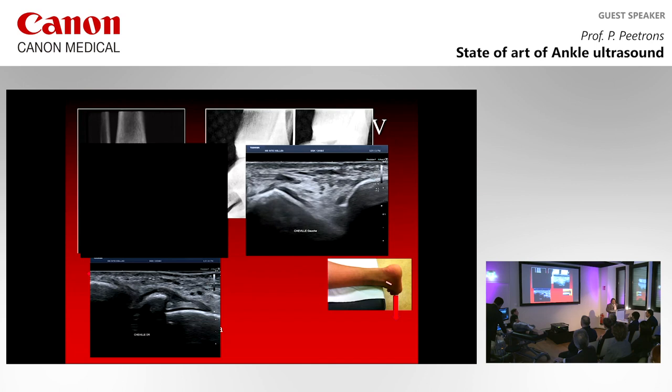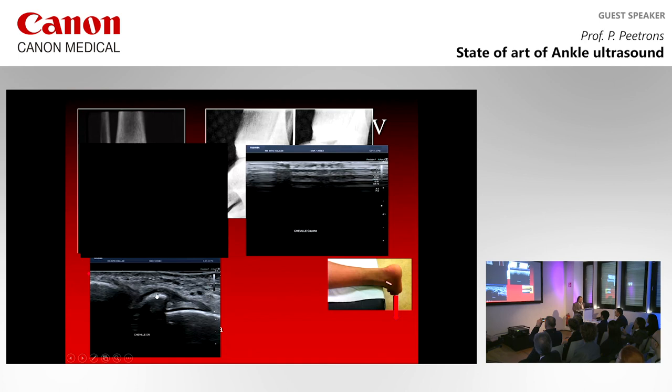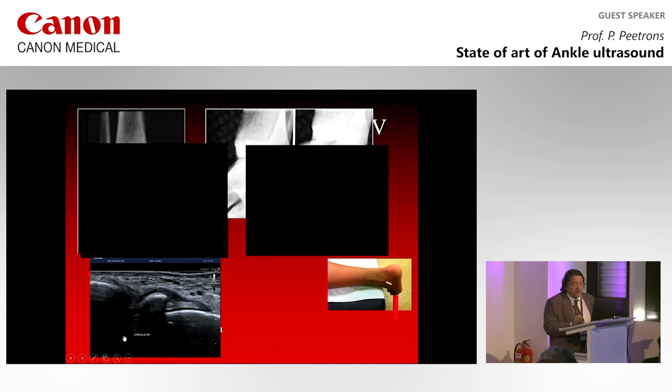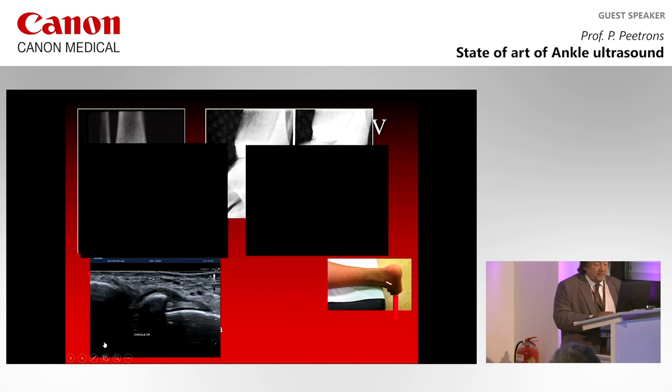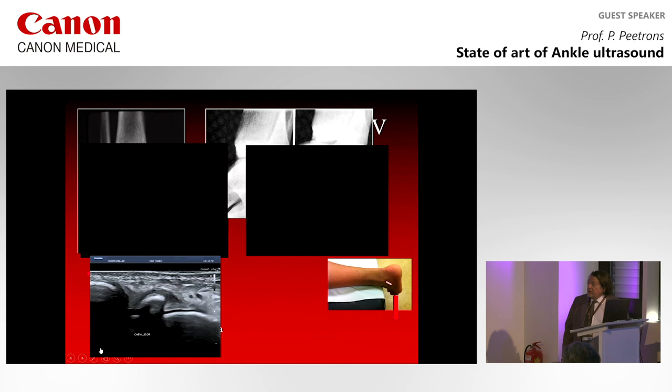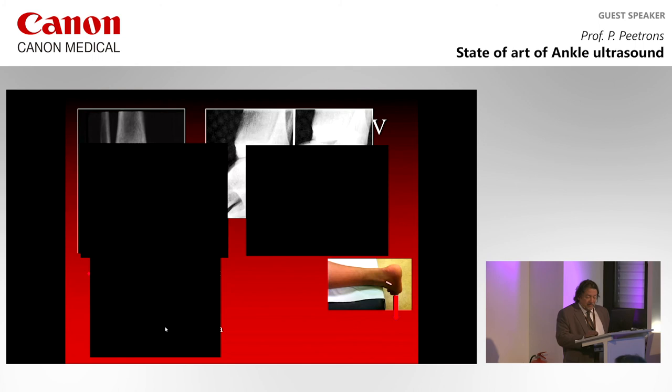This is another one where you can see that the ATFL was torn and there was a heterotopic bony fragment inside the ATFL. So is this bony heterotopic fragment a very good structure for the ATFL? Is it holding the ATFL to the fibula or not? The patient is complaining of instability. So we ask her to move, we pull the foot, and you see that this bony heterotopic fragment is completely loose from the fibula, and that there is an ATFL instability.